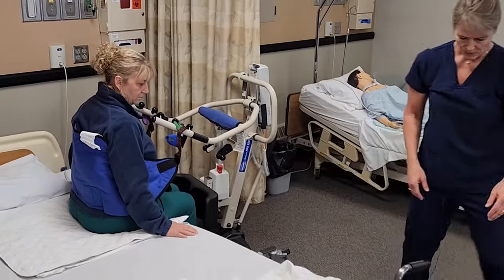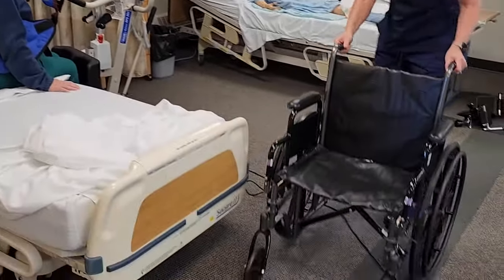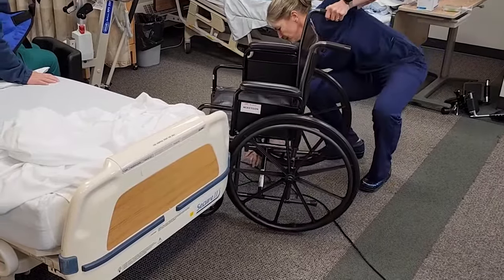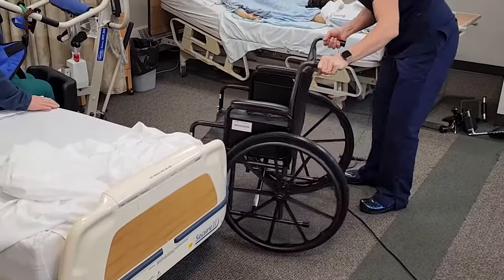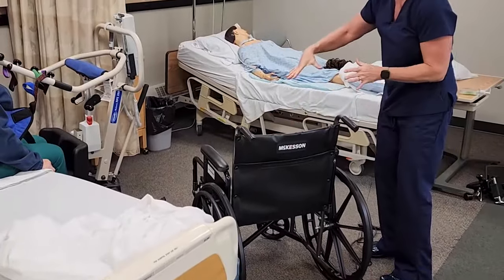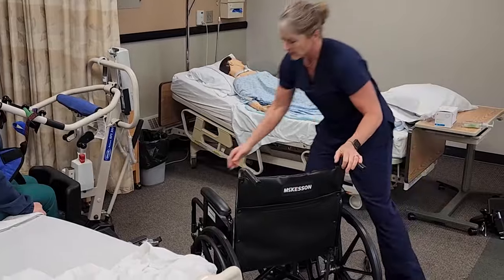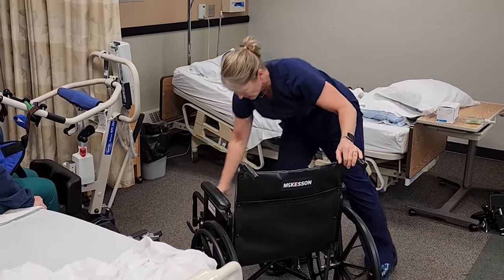I'm going to get your chair ready while you're sitting there. We want to try not to move the resident too far, and keep the chair facing the way they are so we don't have to spin them around to the lift. Make sure the foot pedals are off the wheelchair and that the brakes are on.